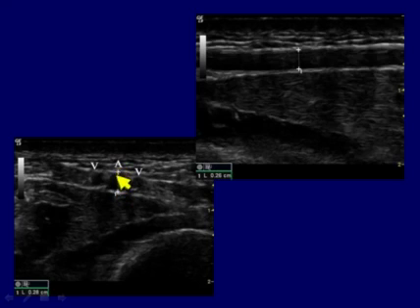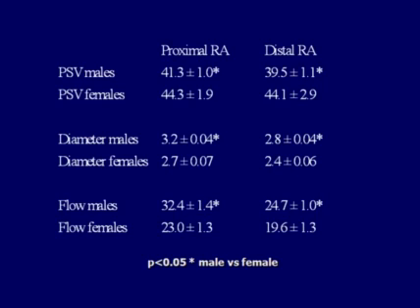and we can best appreciate that we're not oblique to this artery. You can do it sagittally, but we have to be very careful. In this example, the vessel measured sagittally was 2.6 millimeters versus 2.8 millimeters transverse. That's all right, but if somebody is borderline, we want to be careful and make sure we don't disadvantage them.